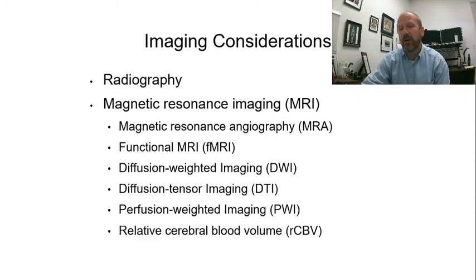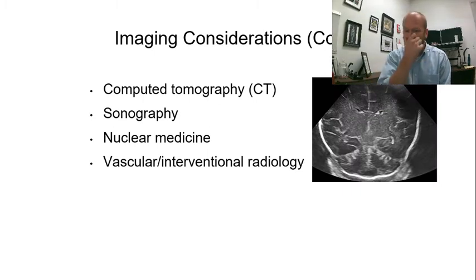We're going to look at some MRI images, so I just wanted to loosely cover what the textbook discusses in this area and make sure that we are familiar with what those images look like. Of course, CT, I'm a big fan of CT, and CT does do a very good job. It has a high sensitivity and specificity, particularly for stroke. In order for us to see things like infection or tumor, oftentimes we do have to introduce contrast for CT. So that's one advantage that MRI has. Oftentimes we can do an MRA without any contrast administration.